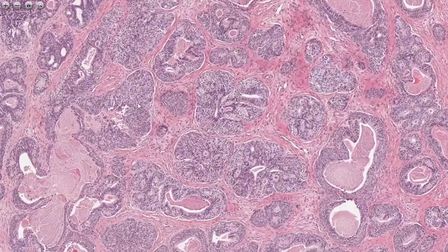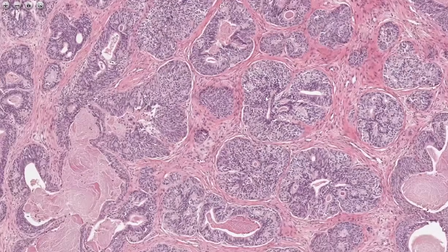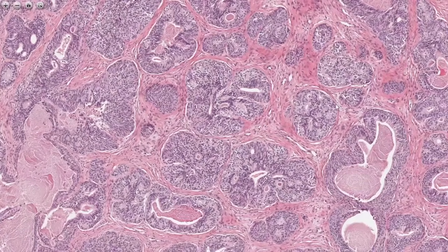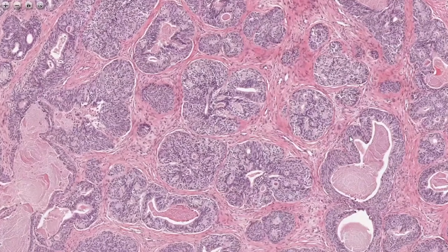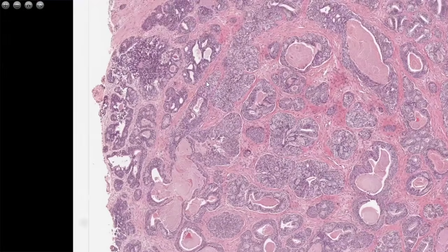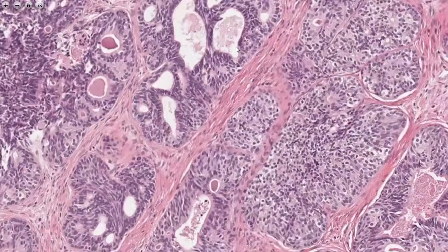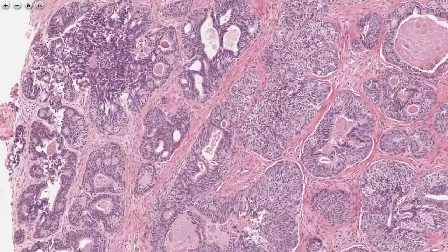It should not be confused with intraductal carcinoma of prostate or the cribriform variant, because these are not true cribriforming. See, glands are fused. No punched out spaces like true cribriform are present here. Again, this is pseudo-cribriforming, right? So there is proliferation of basal cells here.